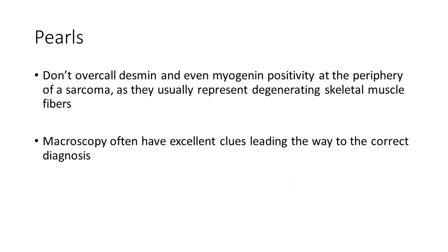The take-home message for this case is, the first one is do not be fooled by the desmin positivity around the tumor. That might represent the infiltrative zone. The second is macroscopy is essential for the diagnosis.